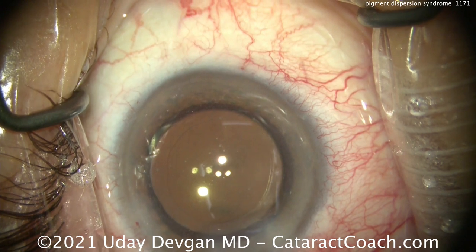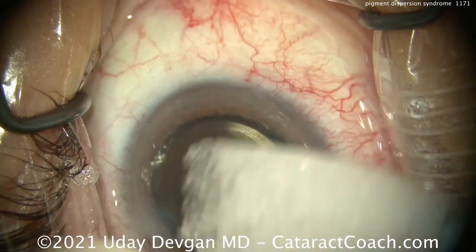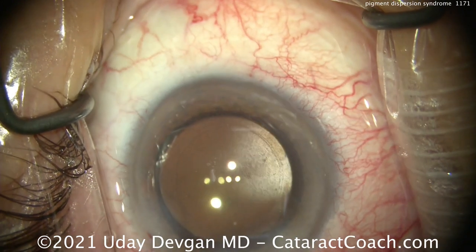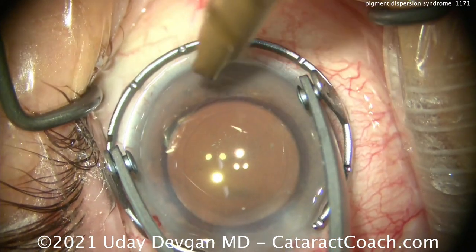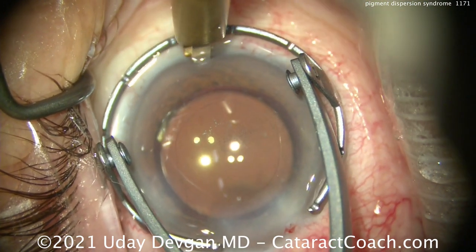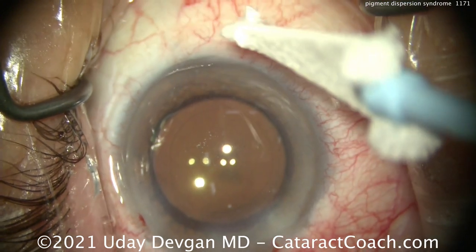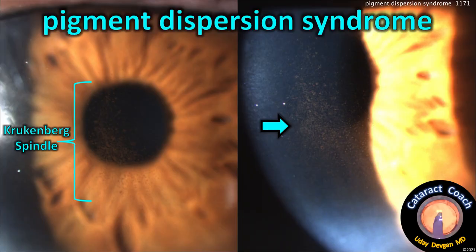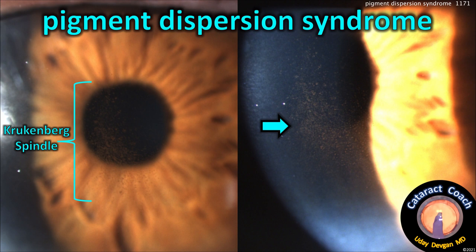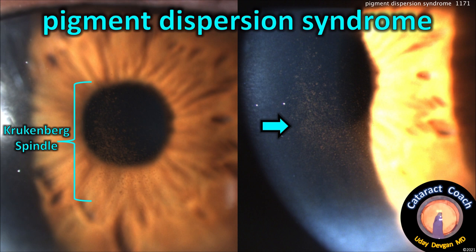Hopefully that will slow down the pigment dispersion in this eye. At the end of the case we'll put in a little triamcinolone and also moxifloxacin — a preservative-free antibiotic. The patient did beautifully. That Krukenberg spindle you saw — the pigment dispersion settled on the central corneal endothelium — has no visual effect. Here we're doing a paired limbal relaxing incision opposite the main incision to treat pre-existing astigmatism. The patient had a beautiful outcome and will follow up annually with a glaucoma specialist. The post-op picture shows the Krukenberg spindle still present in the central corneal endothelium — that pigment originated from the iris and deposits in this pattern due to the fluidic motion of the aqueous in the anterior chamber.